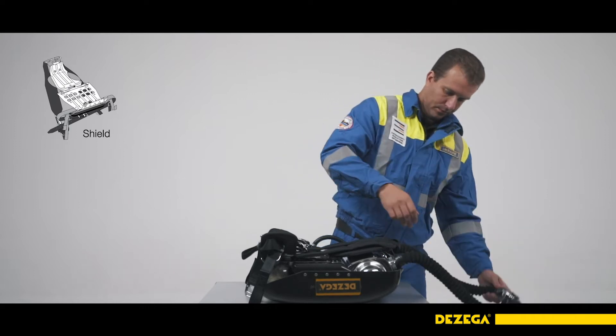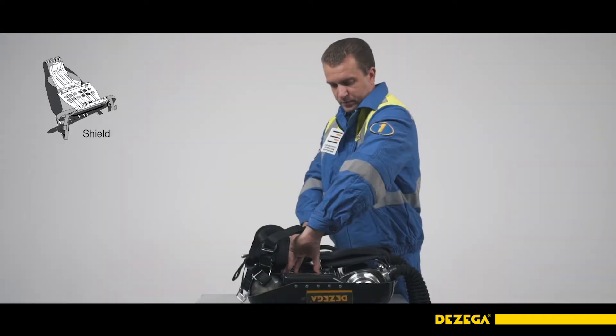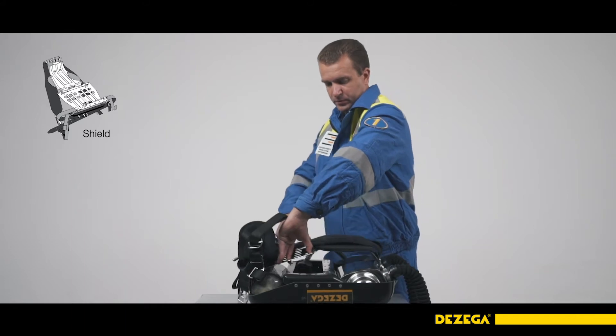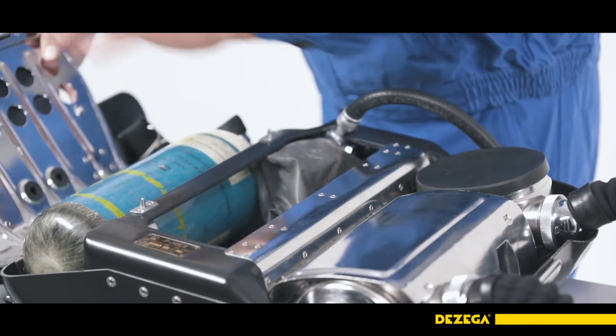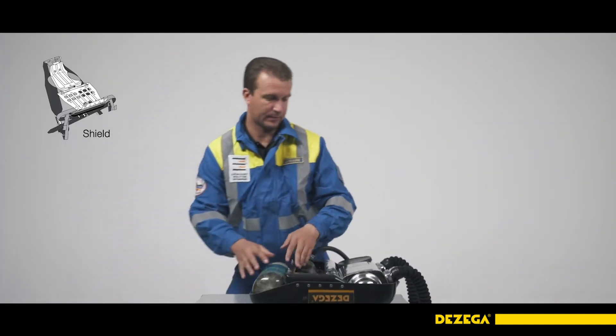In order to disconnect the harness system, press the spring lock and disconnect the shoulder ring. Press the two spring locks in the direction of the waist belt with both your thumbs at the same time. Open and disconnect the breathing apparatus shield.